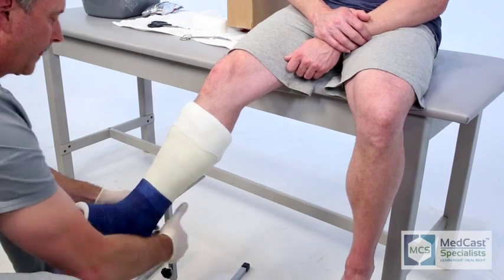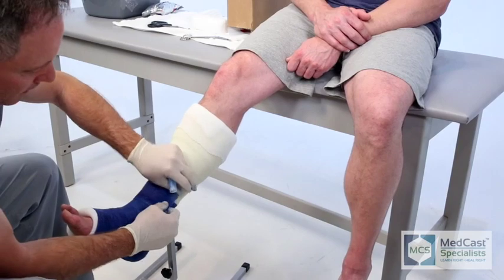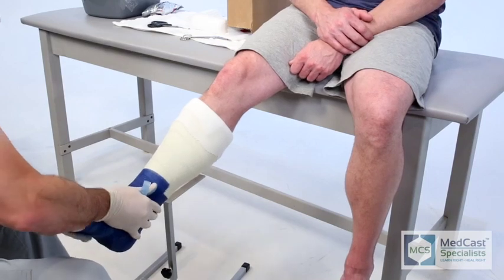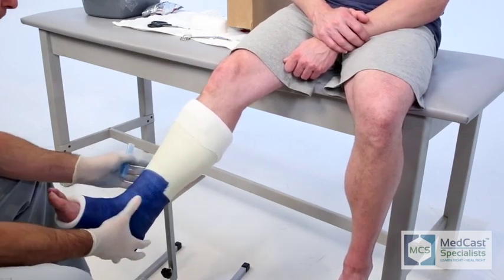Always, once again, check for weak spots. You can capture those with your first roll and then finish up approximately with your second roll. Start your rubbing technique now on the first roll while it's still a little moist.